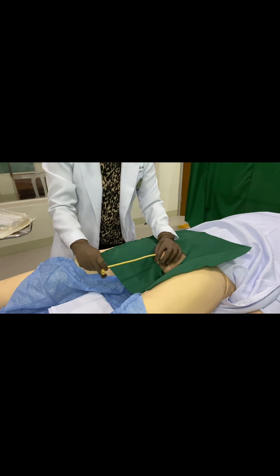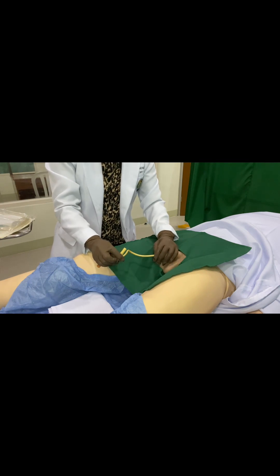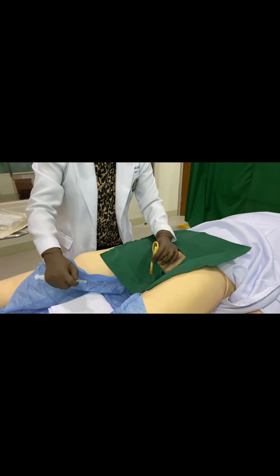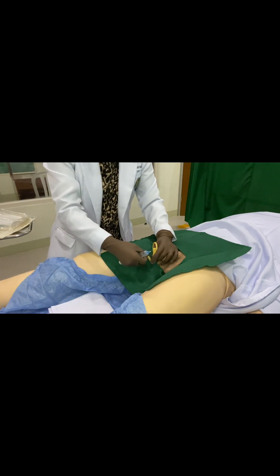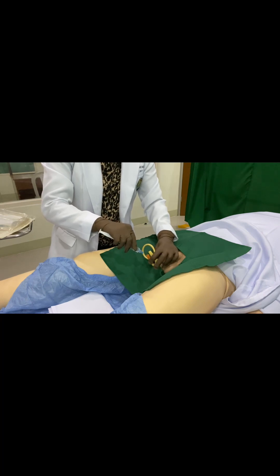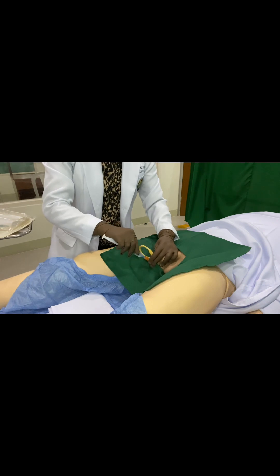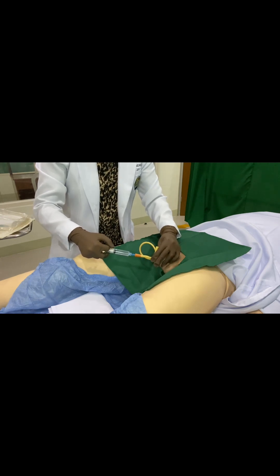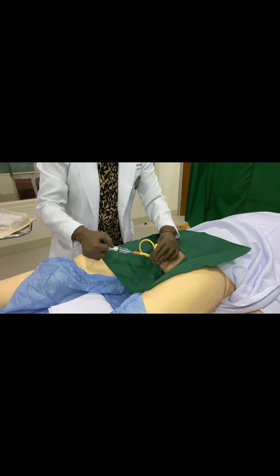Once there is a urine backflow, kink the white port and fold it with your non-dominant hand. Then get your syringe with sterile water and insert the sterile water into the port to inflate the balloon inside the bladder. Once inflated, the balloon will act as an anchor holding the tube in place for up to three days.